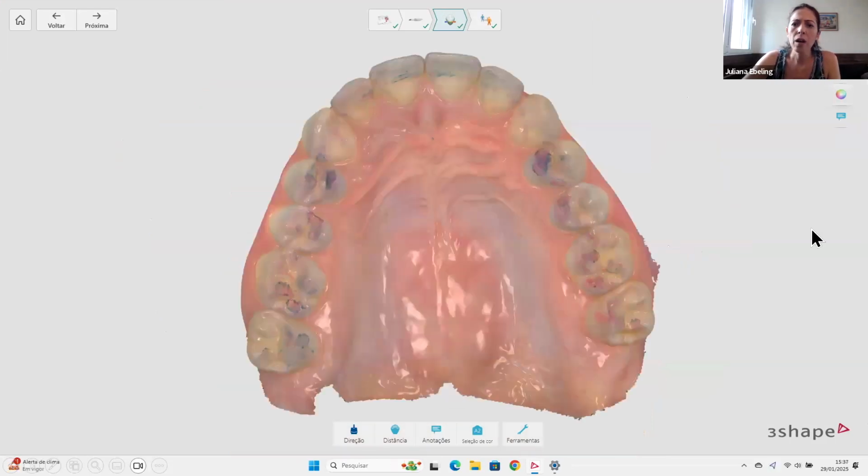And when I check it with the papers, I have this. It suggests that we have more intensity on these premolars, but we don't know. This is very subjective. If I show it to Alina, she will tell me something. If I show it to Marise, she will tell me another perception.